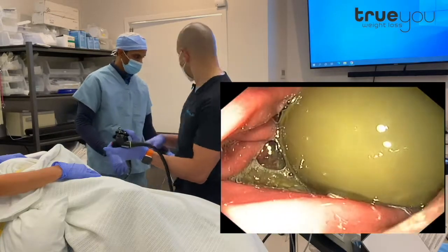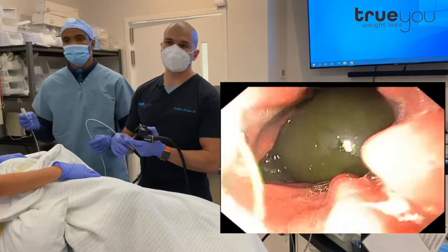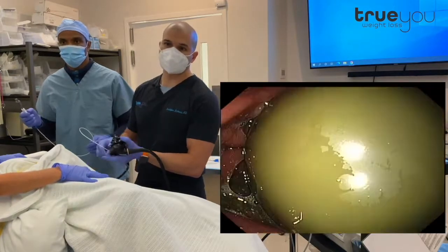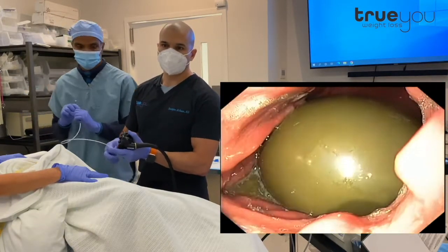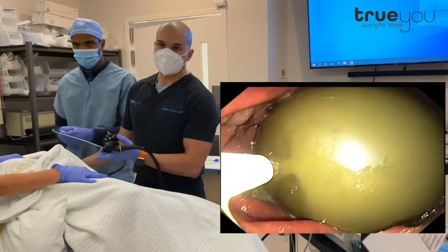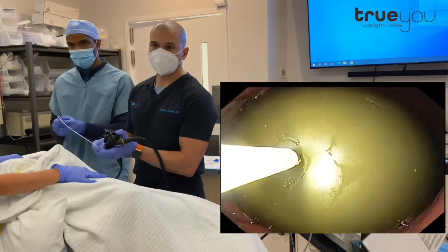Step one is we are going to puncture the balloon with a needle. The needle is placed through the scope, and it allows us to puncture the balloon. This is made of tough silicone, which is why it will not leak on its own. We can puncture it and suck the saline right out through the scope. Here we're advancing the needle, and Victor's going to push the needle out, and I'm going to pop it right into the balloon.